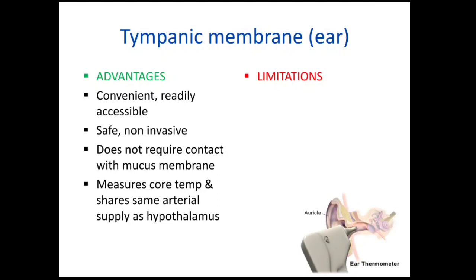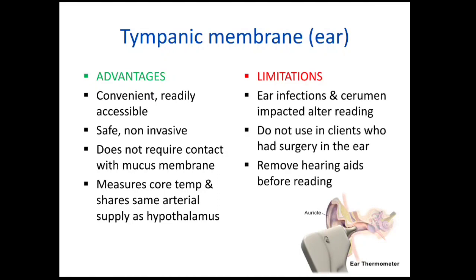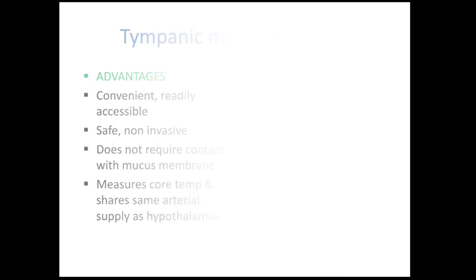But it has limitations. If there is any ear infection or cerumen, it affects the reading. And we cannot use it in clients who had surgery in the ear. Another important point that we have to remember is that we have to remove the hearing aids before reading.